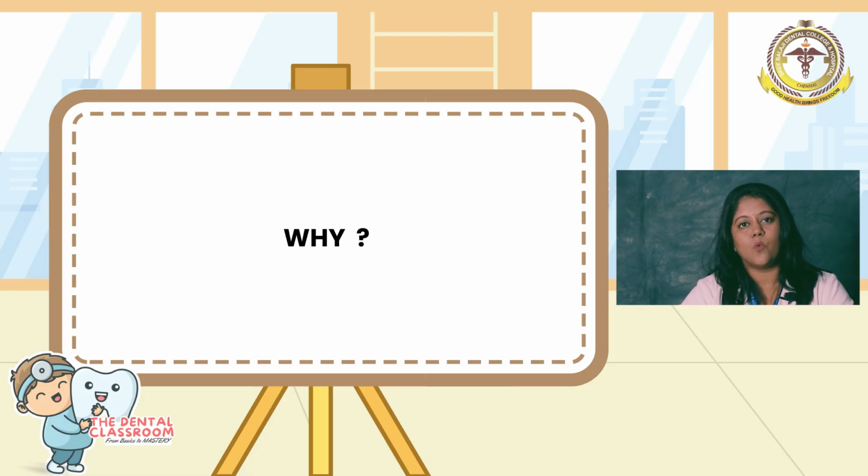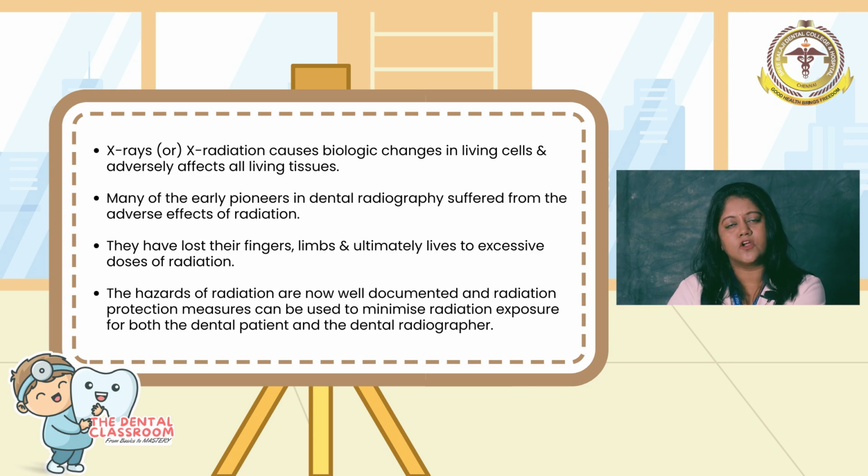First, let's see why radiation protection is important. X-rays or X-radiation causes biological changes in the living cell and adversely affects the living tissue. Many of the early pioneers in dental radiography suffered from adverse effects of radiation. Many of them lost their fingers, limbs, and ultimately their lives to adverse effects of radiation. In the present world, now that the hazardous effect of the radiation has been documented, it is important that radiation protective measures are employed for the dentist and the patient as well.